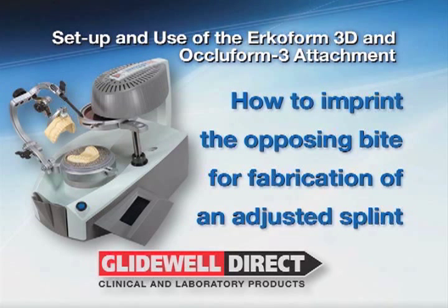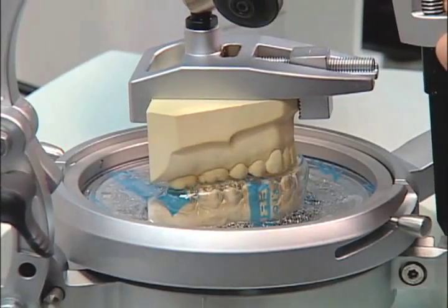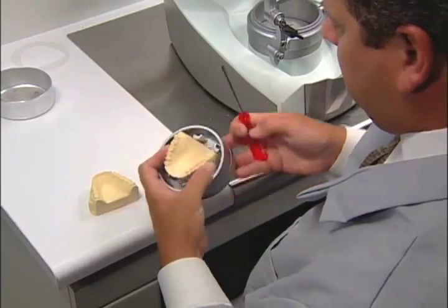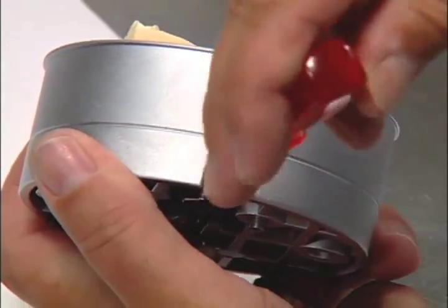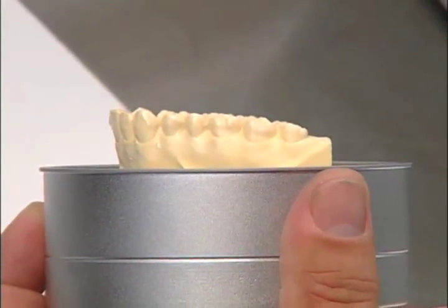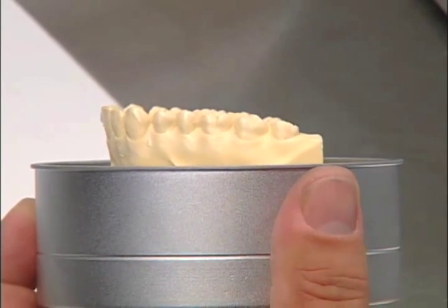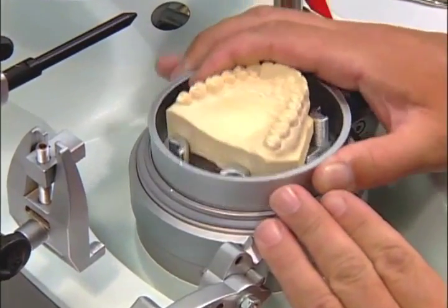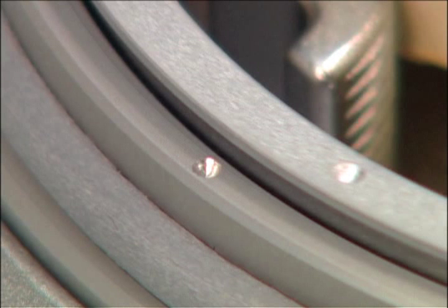To make an imprint of the opposing bite when using the Ocloform 3 for an adjusted splint, you'll first need to clamp the model where the foil should be thermoformed in the model pot. Using a hexagon socket wrench M on the model pot, carefully clamp the model at a slight tilt. Note that it's useful to secure the model at an angle, for instance when undercuts are present. Place the model pot with the model into the unit and be certain the marking points are directly opposite. Once the points are lined up, the model will engage into the centering plate of the unit.